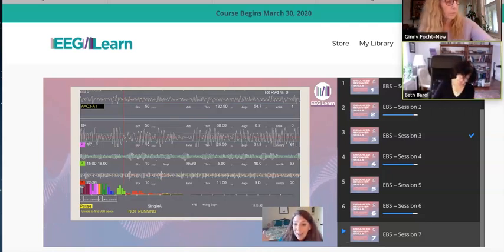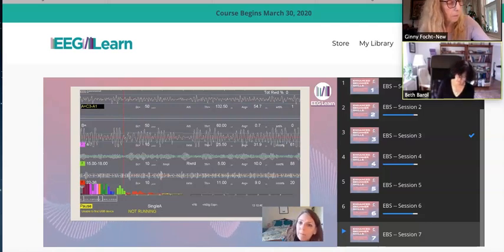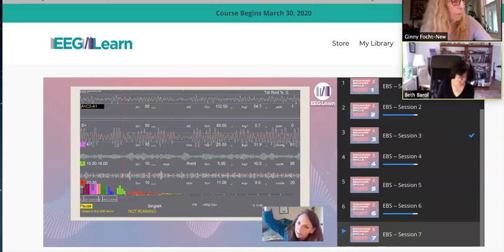And if it's going up, I want to know where your mind is, or what you're thinking about, or what your mind is telling you. Okay, and then hopefully sometimes we have to help catch them at first. So if their purple line is going up, the violet line is going up, or if you're letting them watch this therapist screen.